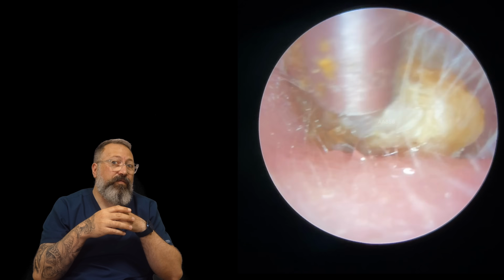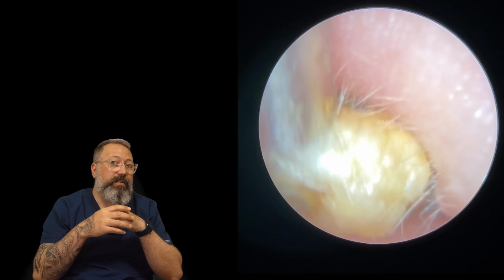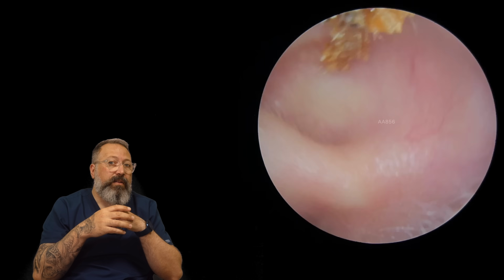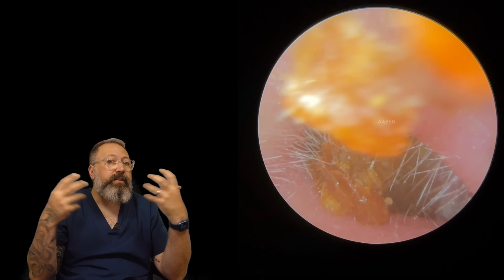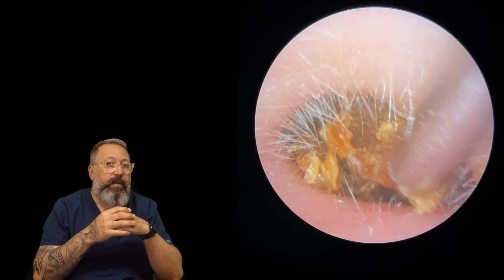You can see that is fighting me every millimetre of this ear canal. Giving this a good old wiggle there to break it apart. There we go. That did not want to come up, but it's pulled another section forwards. So now we're starting to see this whole plug breaking down, loosening up, all these keratin strips all coming away here.